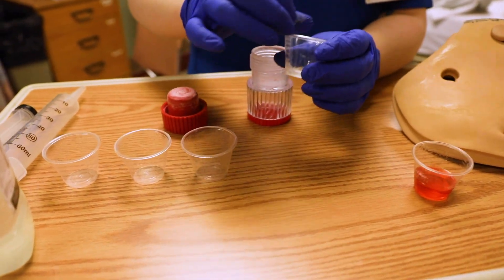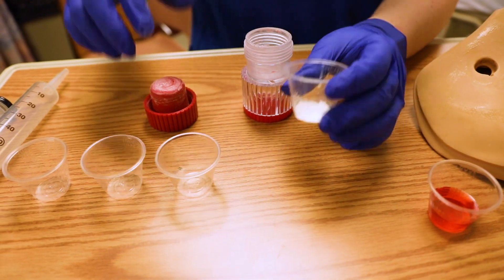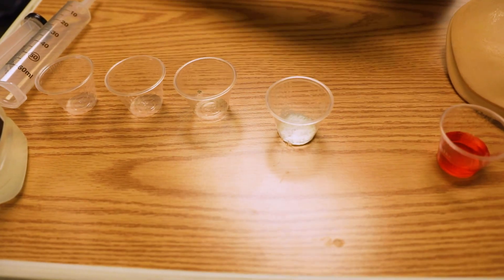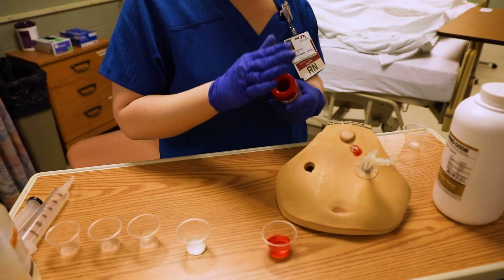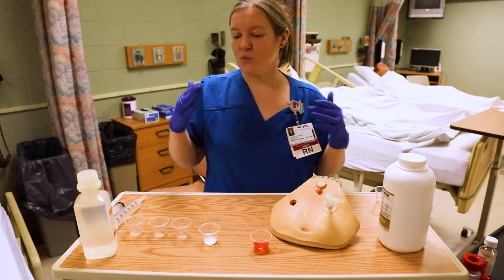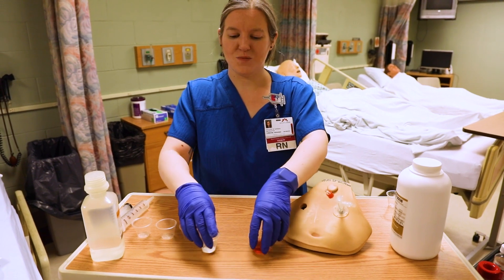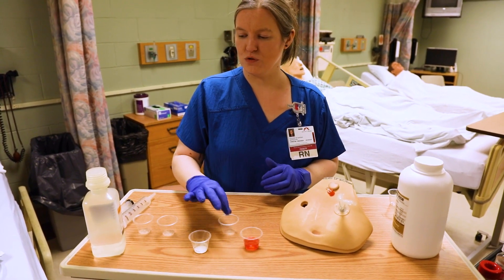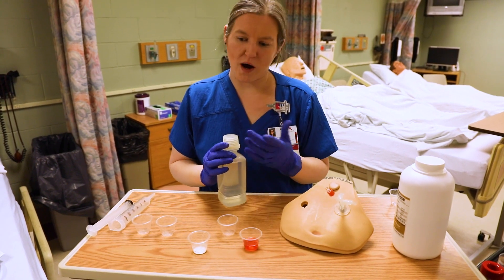If a patient has a G-tube at home, sometimes they'll use tap water. We don't recommend that in the hospital because there are a lot more germs involved, so you want to use whatever you have available — usually sterile water.